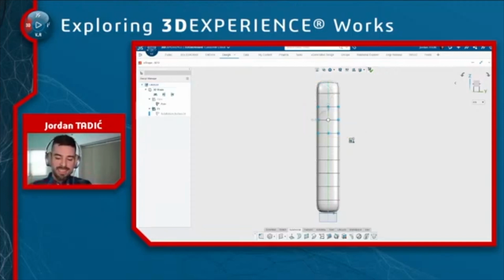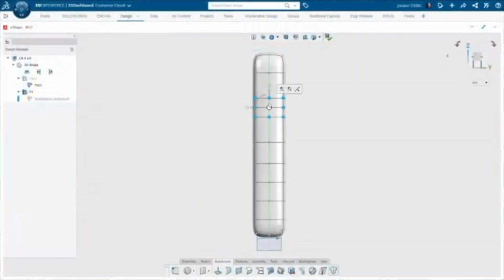Now, I need to scrunch down the little wrinkle sections. And you always got to pay attention. The robot, the manipulator on the screen, is going to center itself to what you select. So I can't do them both at the same time. I have to do them individually. That will center the robot at the center of that little wrinkle. And then I could scale those entities down step by step. So just keep that in mind.